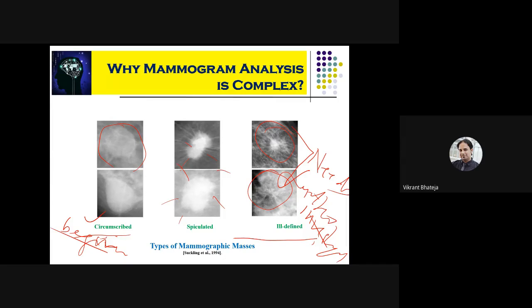But there is also a third category, where the image cannot truly be called a cancerous one, or a benign one, but which needs further investigation or analysis. But if you are designing in a conventional way, you are just designing a binary output kind of machine learning tool, where you have just two types of responses, that is cancerous and non-cancerous.